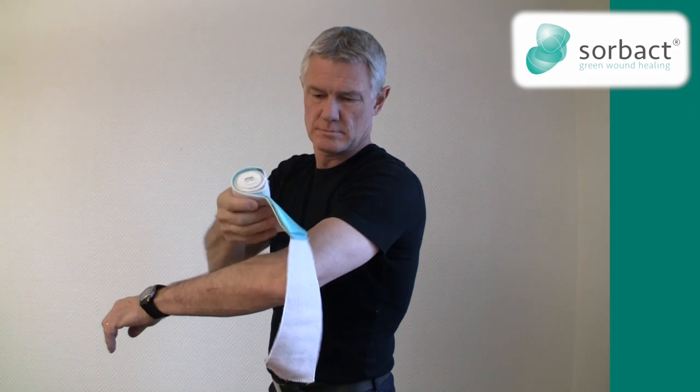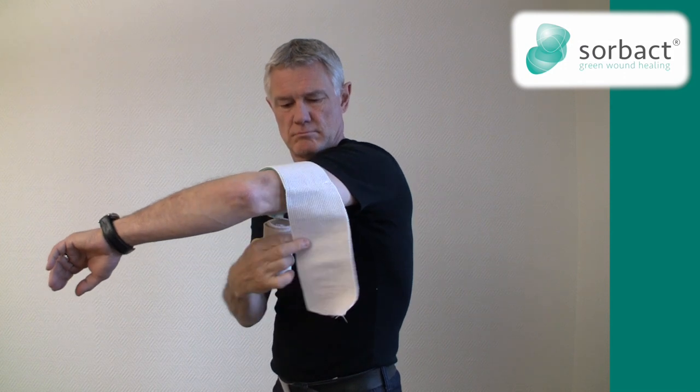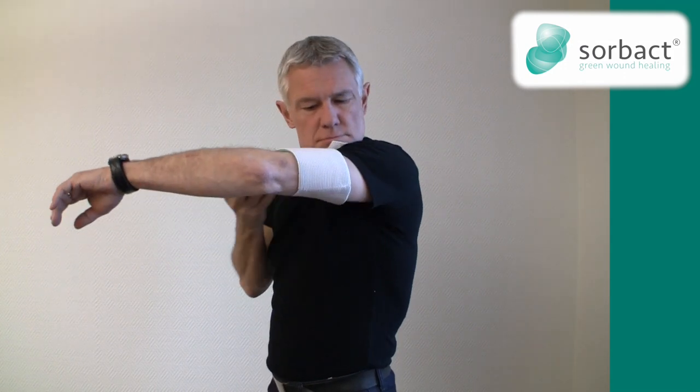At the beginning of the bandage there is a short strap that will help you to fixate the green absorption dressing on the wound.